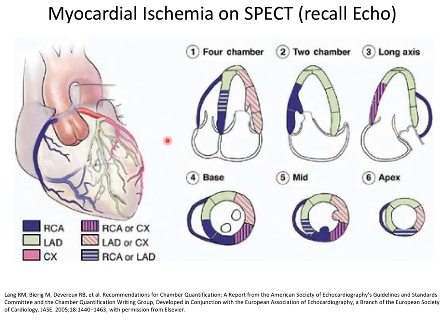And again, recall back when we looked at echocardiography to report what's going on, you use segments of the myocardium. And the traditional division, again, is 6 segments in the short axis views: 1, 2, the base, mid, and apex views. You have 6 in these and 4 in this one. And these are picked to be a size that corresponds roughly to the size of a perfusion bed of a specific coronary artery. So fairly low resolution.